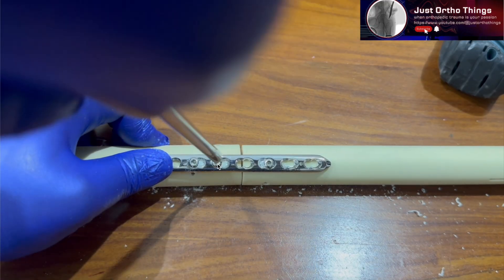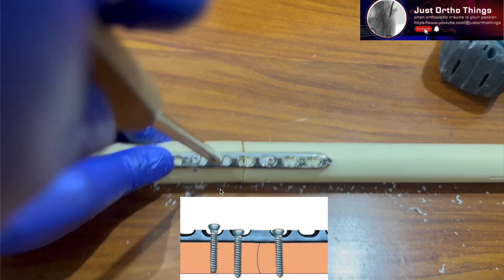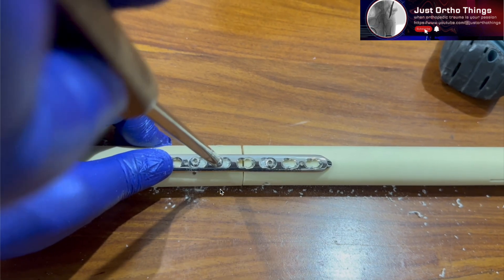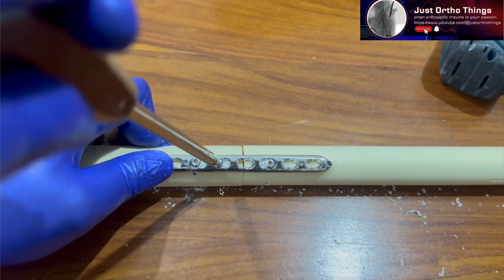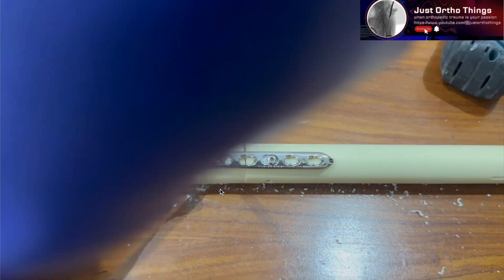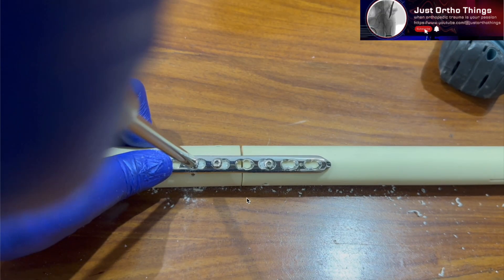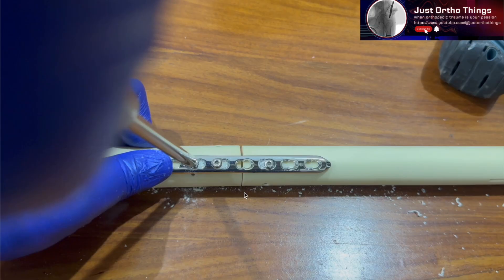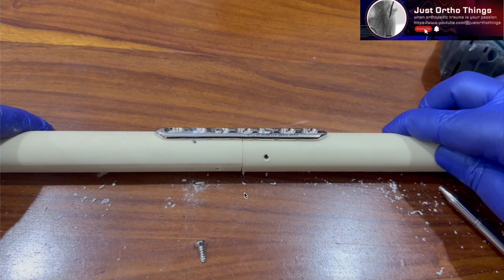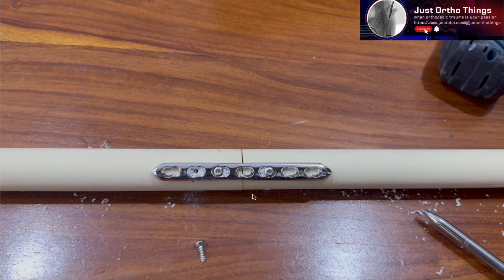After loosening the head of the first eccentric screw, tighten the second screw fully. You can see the fracture side getting approximated as tightening continues. The fracture gap reduces progressively until it is nearly nil. This is a sawbone model so some surface irregularity remains, but the fracture is fully compressed. You have gained 2 millimeters of compression using this technique.